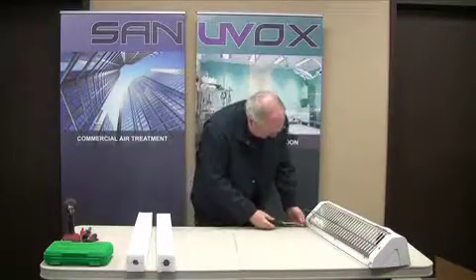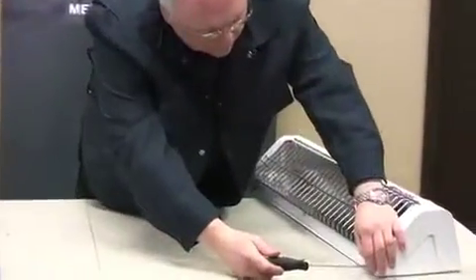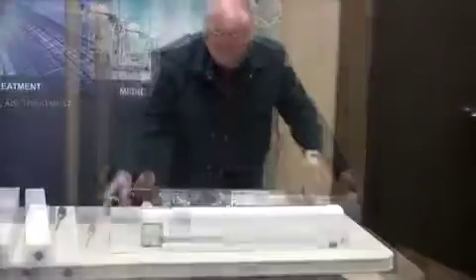Using a Phillips screwdriver, remove the two screws at the bottom of the unit cover. With an upwards motion, remove the cover as demonstrated here.